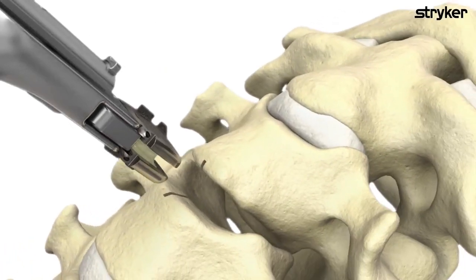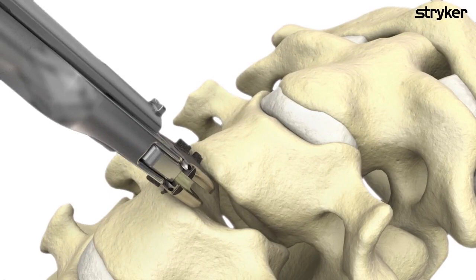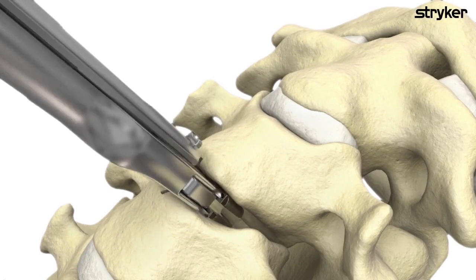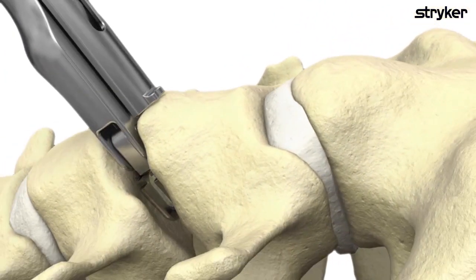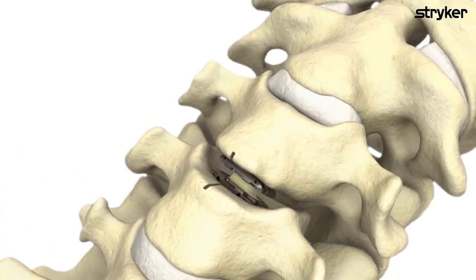Once the desired anterior-posterior position of the disc has been set, align the disc within the keel path created within the disc space and continue with implantation. After the disc is properly seated within the disc space, rotate the proximal knob of the inserter in a counterclockwise direction to disengage the disc from the inserter.